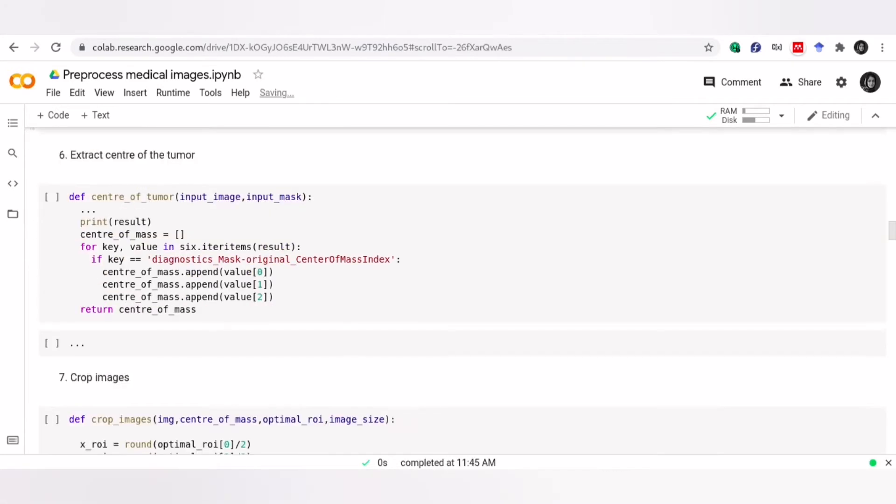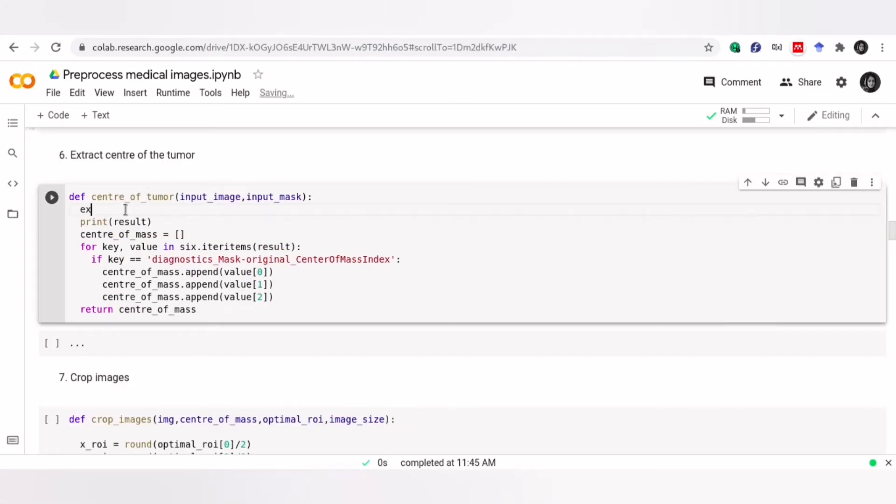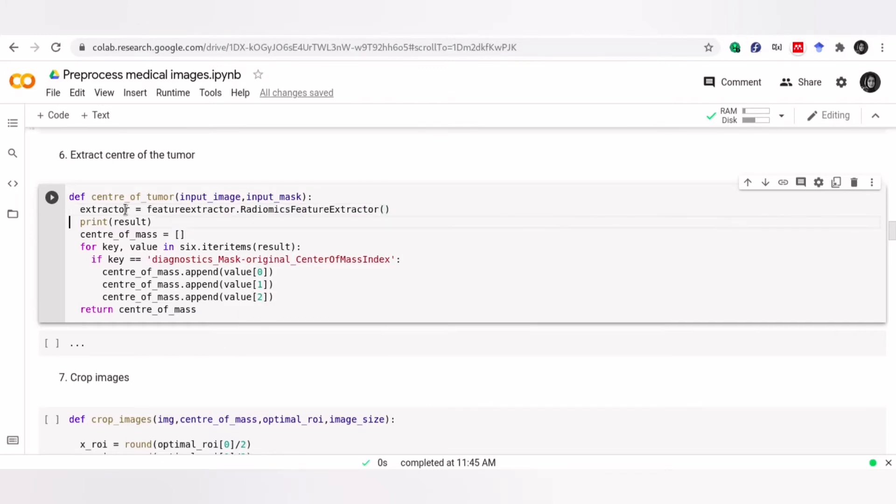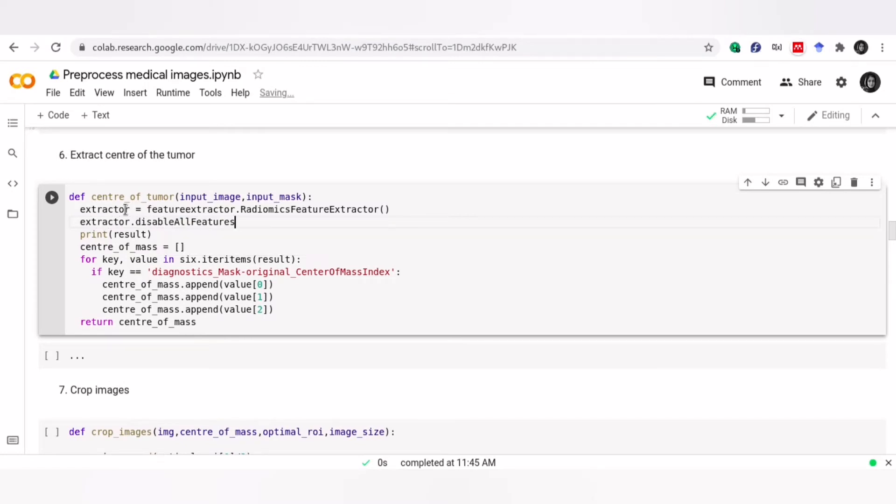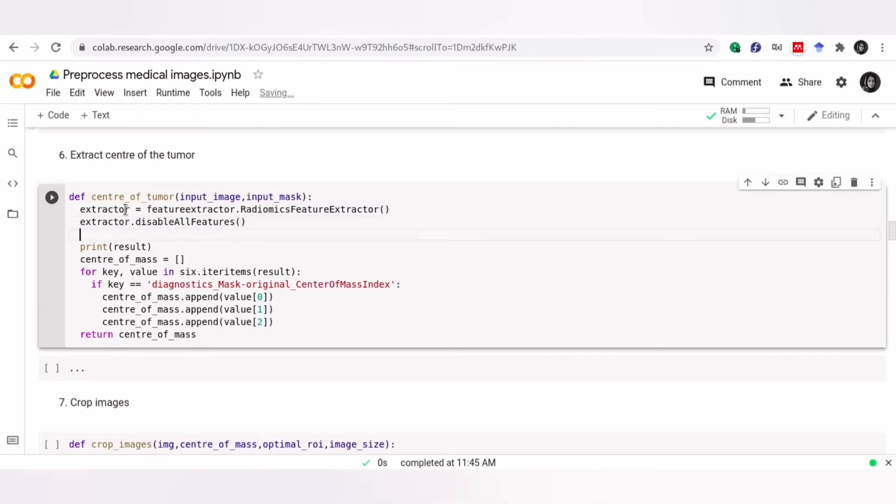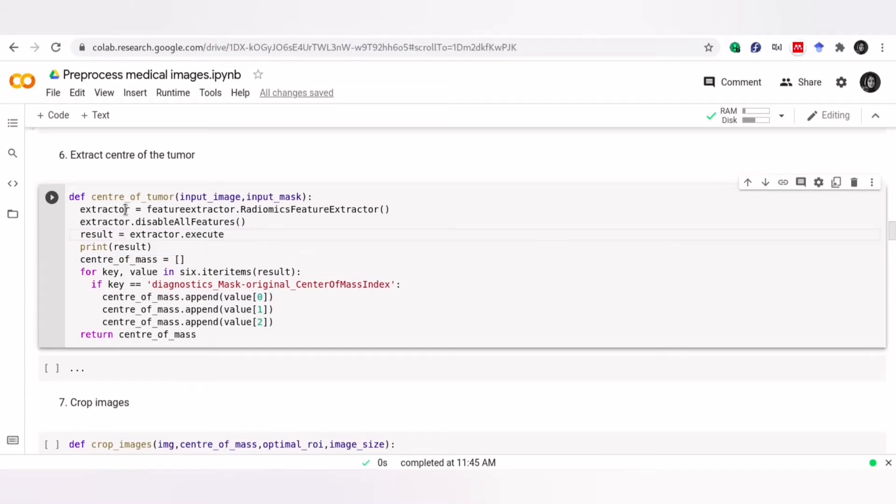To define an extractor, we need to call radiomics feature extractor. By default, all features in all feature classes, such as GLCM features or shape features, are enabled. So, we need to disable all of them, as we just need the center of mass. Finally, using execute, we generate our features.